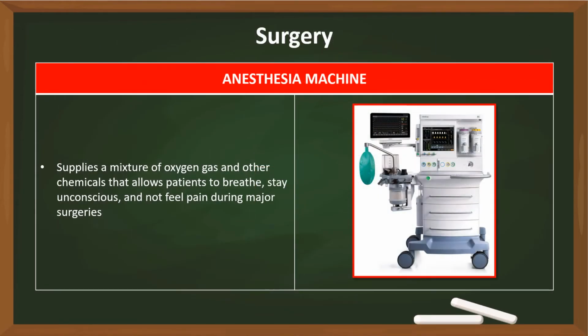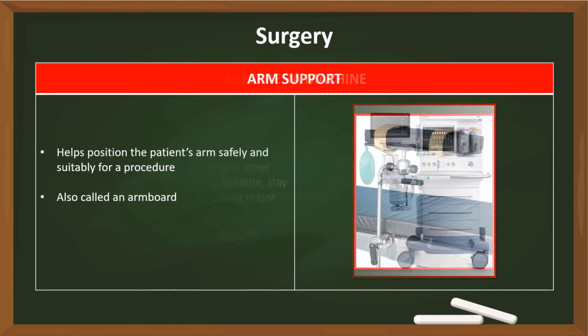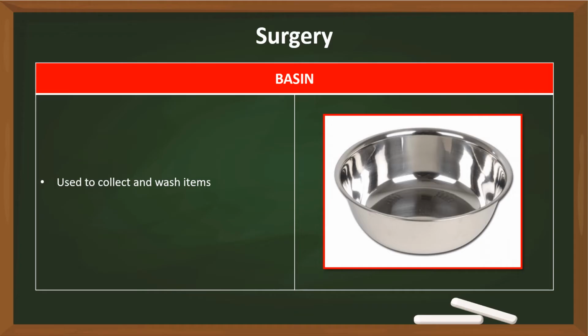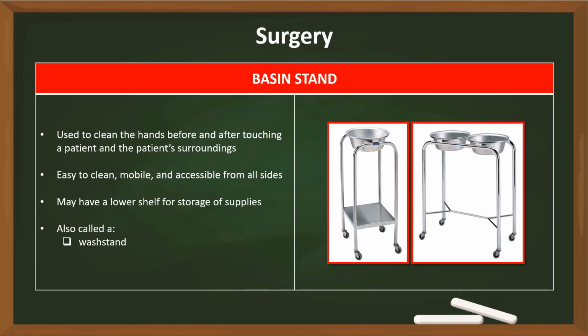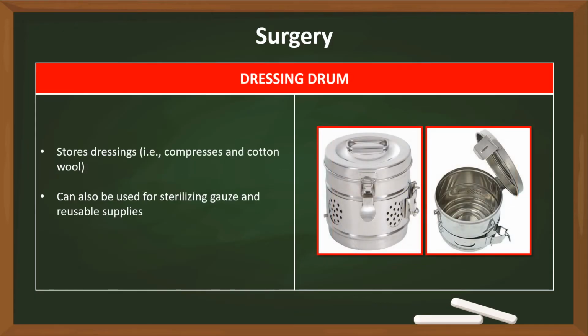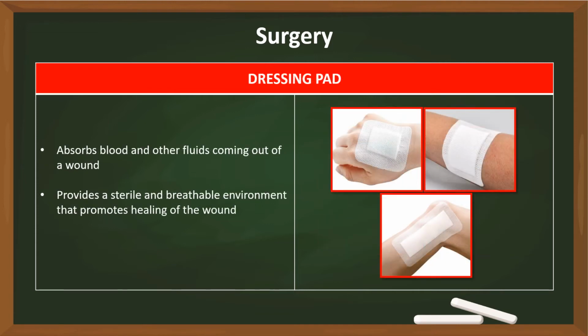Anesthesia machine. Arm support. Basin. Basin stand. Cotton wool. Dressing drum. Dressing pad.